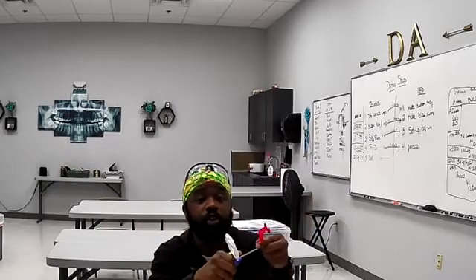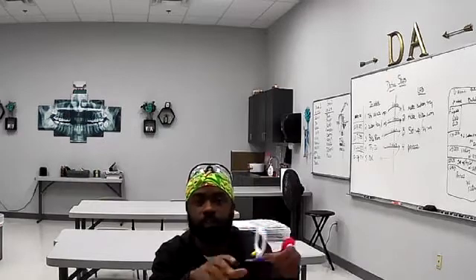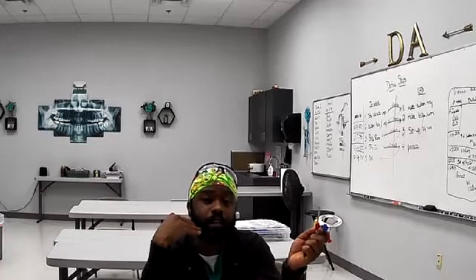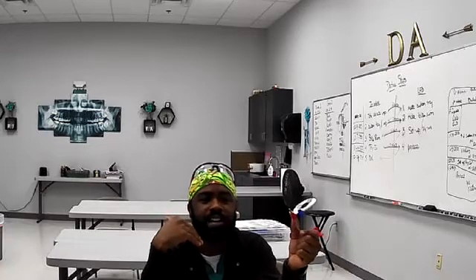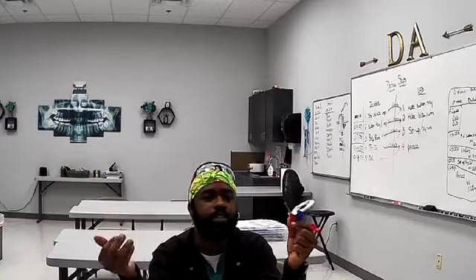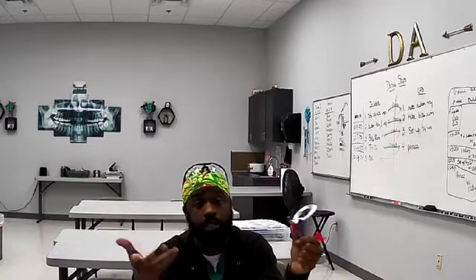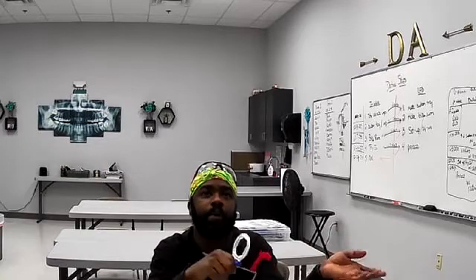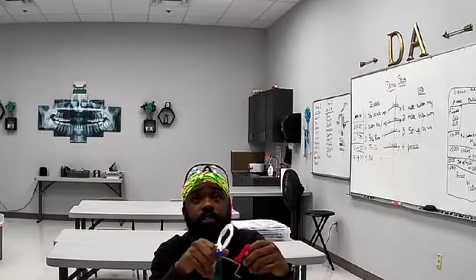If the patient is due for a bite wing, I'll go ahead and take one before we even get started, whether it's a cleaning or if we're working on that side of the mouth. If we're not working on that side of the mouth, then I will go ahead and talk to the doctor first before doing it because you don't want to waste time that you could be using. But I go ahead and put my patient back and I take bite wings first.